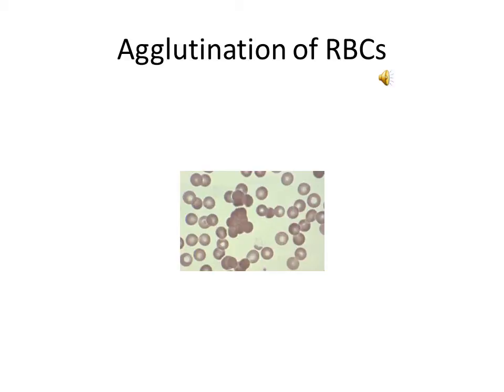This agglutination, you'll see it because it occurs when the tube is being drawn at room temperature. You'll know there's something going on as it goes through the machine because the MCHC will be greater than 36 and the MCV will be high. You'll also notice when you look at that automated result that the red blood cell count will look too low in regards to what it should be with the hemoglobin level. When you warm the specimen up to 37 degrees, this will cause the agglutination to disperse, therefore giving you an accurate MCHC and MCV reading and a nice looking peripheral smear, getting rid of that agglutination.